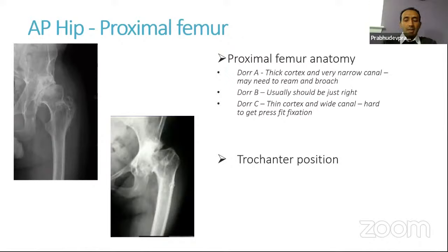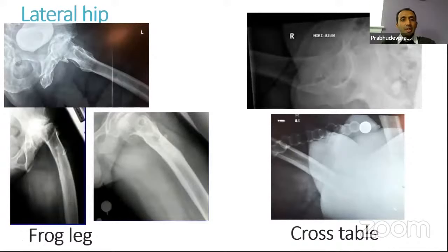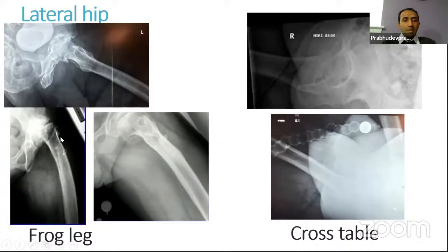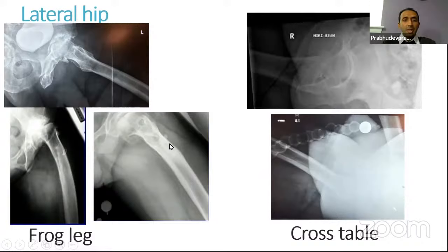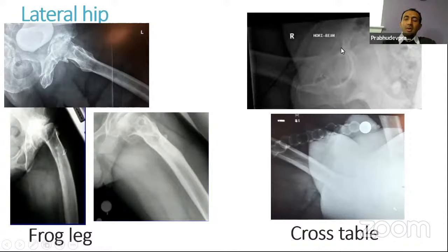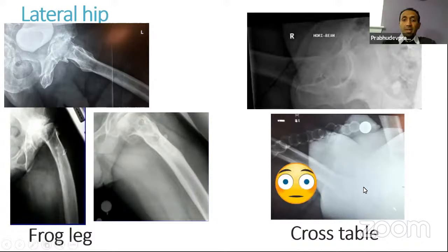A good lateral view of the hip is important — ideally a frog leg and a cross-table view. The frog leg gives better information about the proximal femur, helping us look for any deformities or increased bowing. You can see a standard femur bow here with no significant deformity, versus significant bowing or deformity from a previous fracture in other cases. The cross-table view gives more information about the acetabulum — sometimes the anteroposterior width may not be as large as the superior-inferior dimension. However, it is not always easy to get a good cross-table view, especially in large patients where the acetabulum is difficult to visualize.